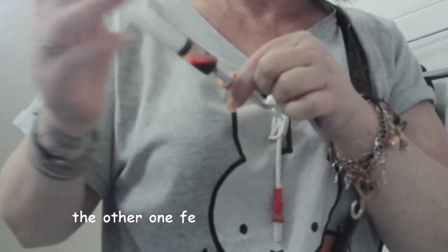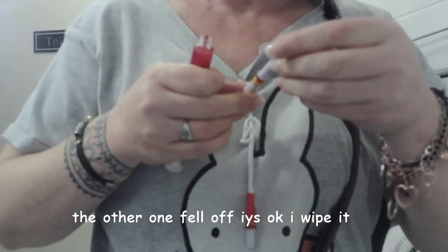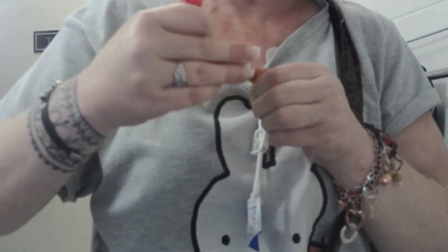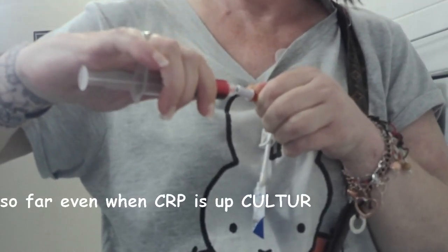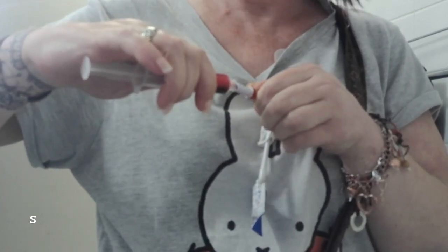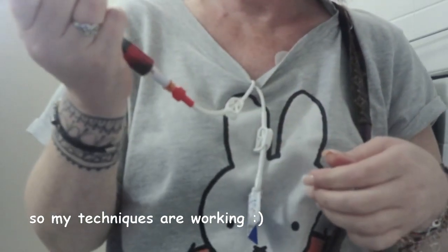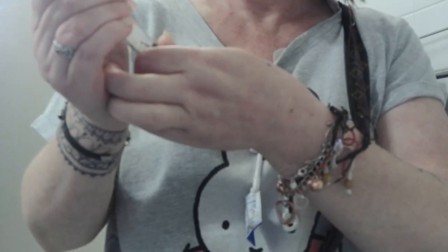Lock it. So that one's done, so I'm going to put that back in there, and I'm going to grab this one and I'm going to just aspirate this one. I don't need to flush this one too. This is the bloodline, so it aspirates lovely. There we go. Blood out.